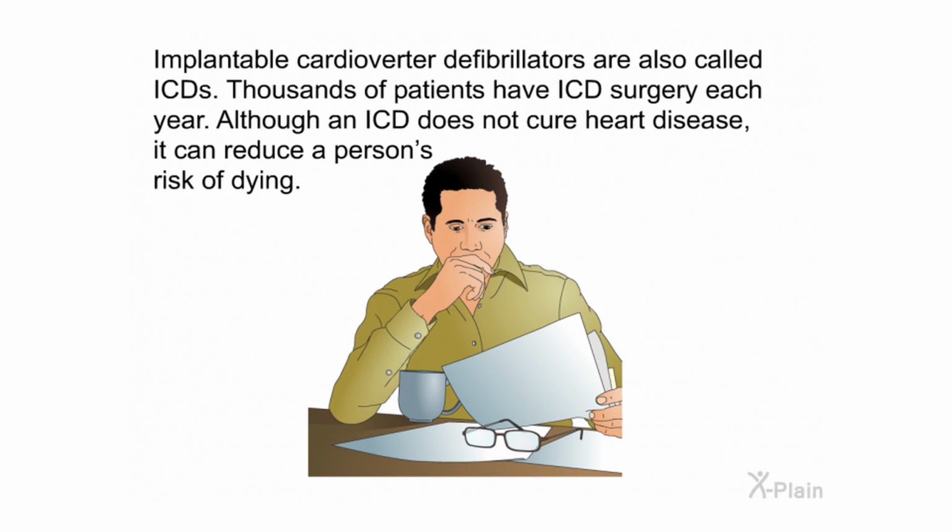Implantable cardioverter defibrillators are also called ICDs. Thousands of patients have ICD surgery each year. Although an ICD does not cure heart disease, it can reduce a person's risk of dying.